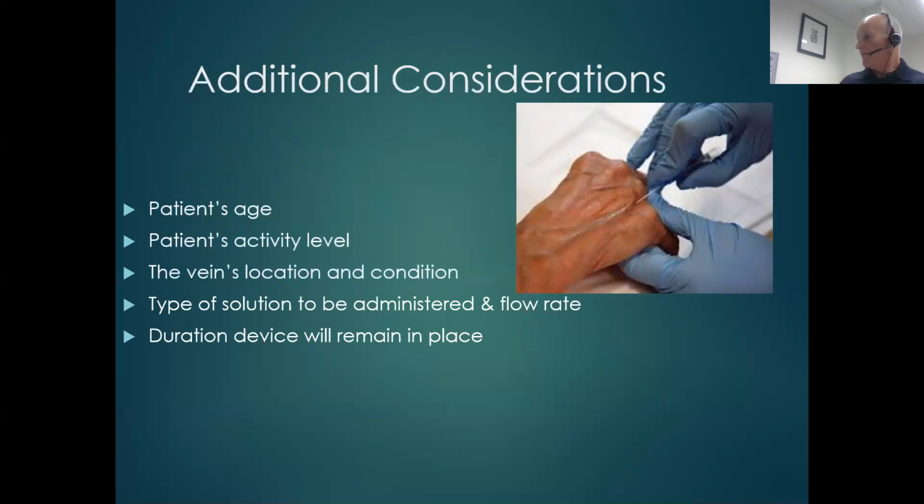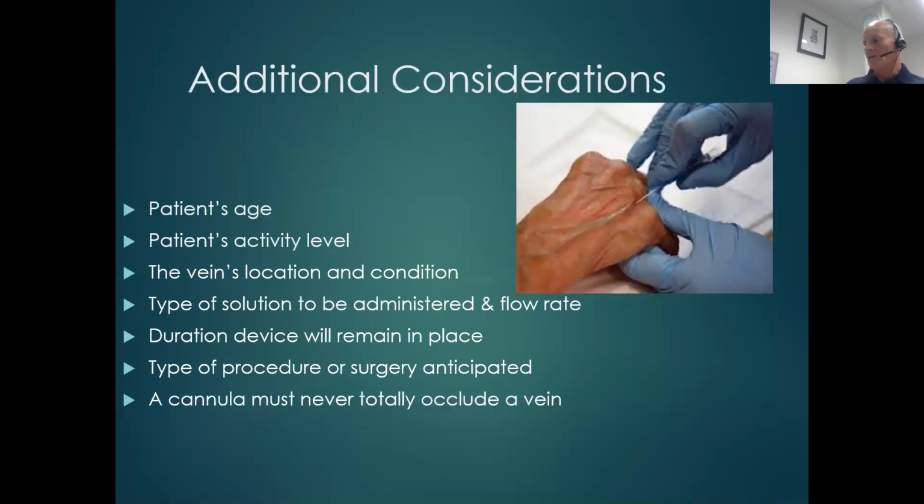Duration for the device, that the cannula will remain in place. A lot of it obviously from a pre-hospital point of view, we don't take into consideration that too much, but if you're out on site, you may have to have some there for an extended period of time, so it's something to think about. Type of procedures or surgery that's anticipated. A cannula must never totally occlude a vein.